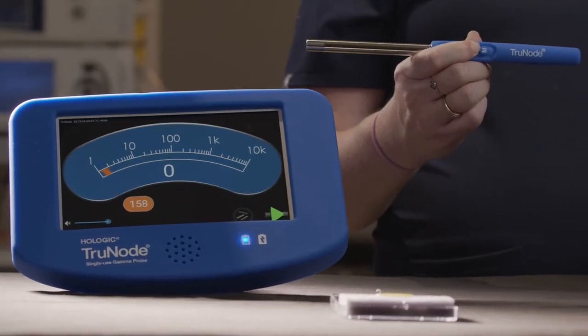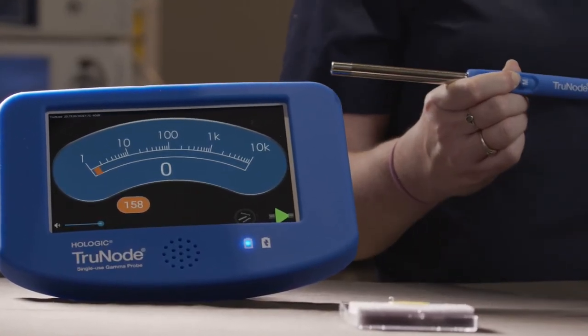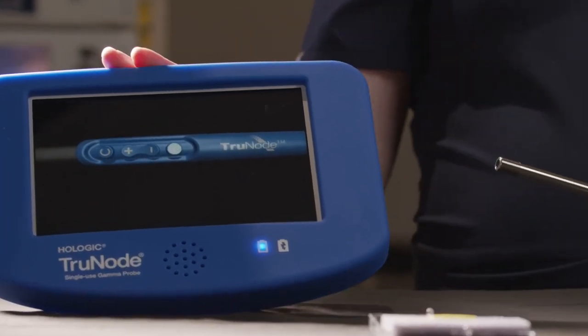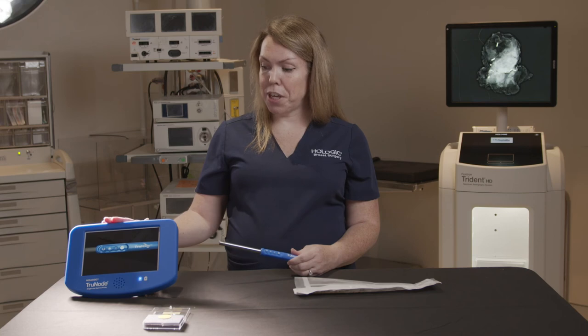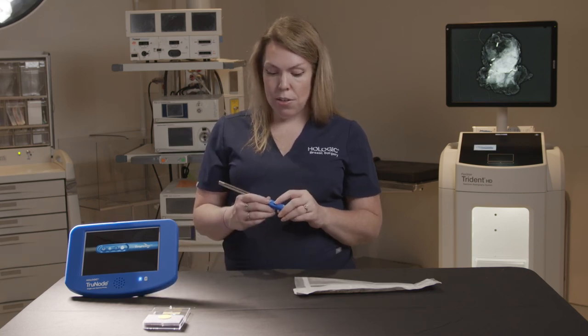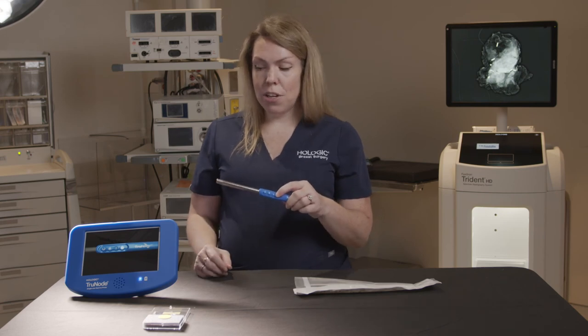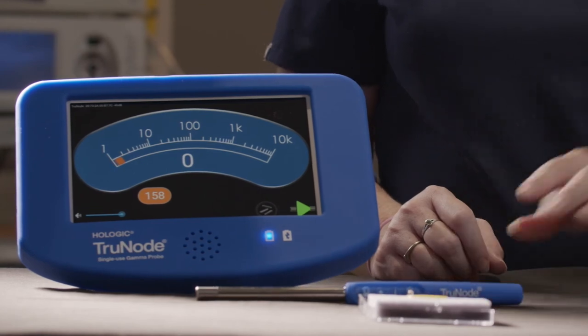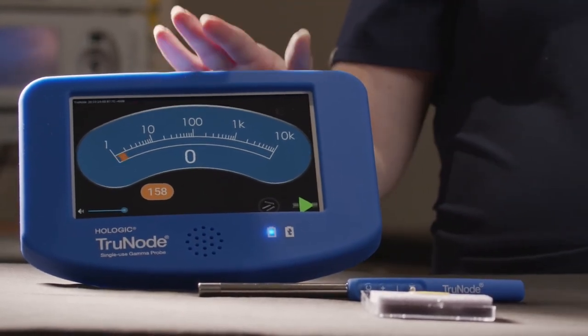If you wanted to actually pause the probe from being used to conserve the battery, we can actually hold the minus button down. We'll hear it announce low range, and we'll keep holding it — that actually returns our UFU tablet back to the default screen and is preserving the active use battery for the rest of the case. To return to active use, just hold the M button in again and now our device is re-paired with the UFU tablet and ready to use.